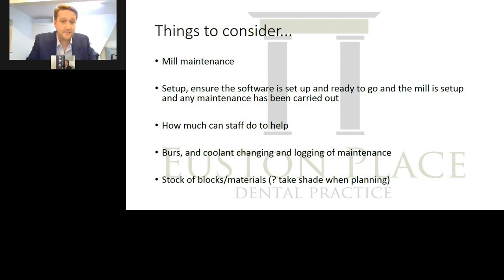Things to consider: mill maintenance. Now my nurse does all the maintenance in the mill, so she sets it up, and there are a few different things you have to do with the roller, which I'll cover in a minute. Set up and ensure the software is started up and ready to go. So you don't want to scan, then get the scan sent off ready to design and get the crown made, and then discover you've got to start up the computer, boot in the software, if it's on a separate system.